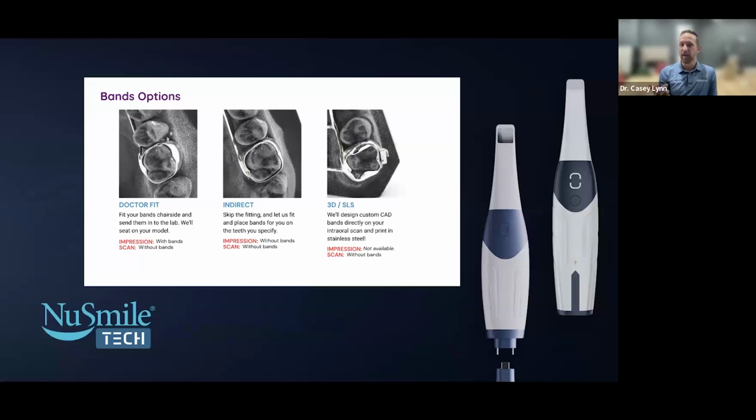If you're doing an indirect band, which I started doing a little bit until I learned more about the 3D SLS that we'll talk about, I'm like, man, I'm not going to be able to get a band on this kid. That tissue's not going to feel good, and that kid's going to lose it in the chair. Just fitting the bands is going to be difficult. Even placing seps, with kids where you're trying to do a Hall crown, placing a sep can be difficult. And a lot of times with these tight contacts, you're going to want to do that. But that was still cementation. I had to think about that cementation appointment. Is that patient going to be super comfortable?